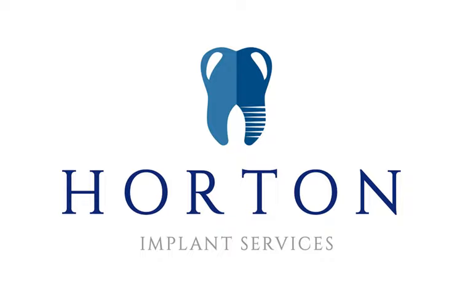And then the patient's coming in for either a provisional restoration or the permanent restoration. So there's what we call indexing, which is the same as taking impressions for crowns or scanning for crowns. And that's where we're recording the position of the implant in relation to the teeth and the soft tissues. And then that will get sent off to the lab. So there's another tracking process that we're looking at: what's been sent to the lab, which lab has it been sent to, what are we looking for, what's the prescription to the lab, shade, all those other little factors, the materials.